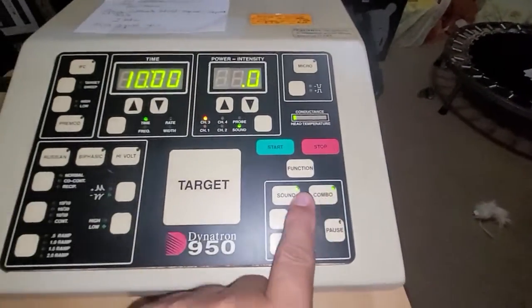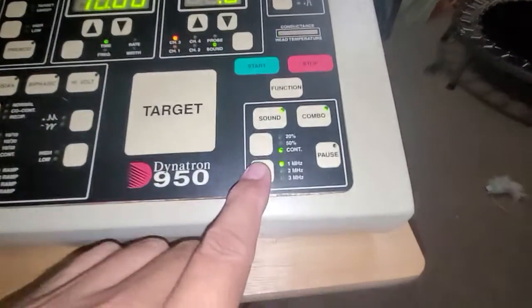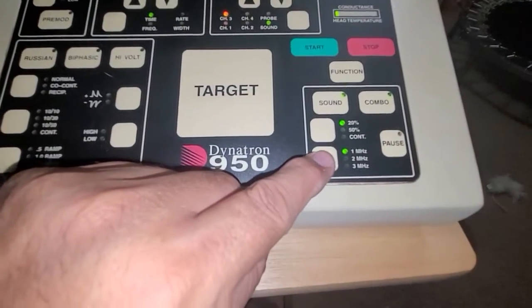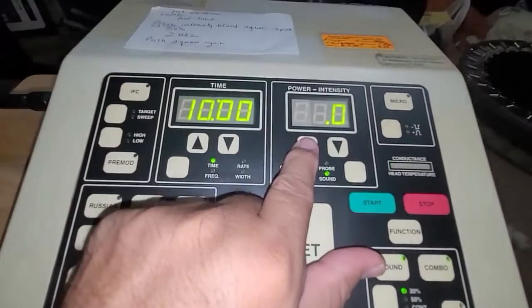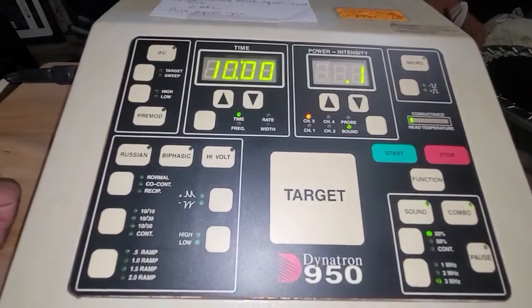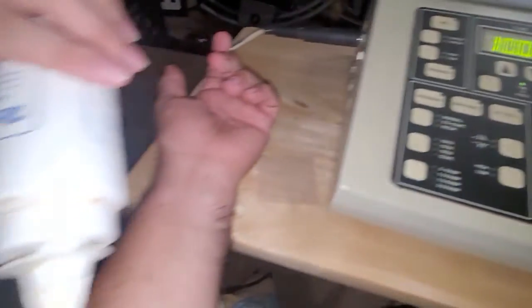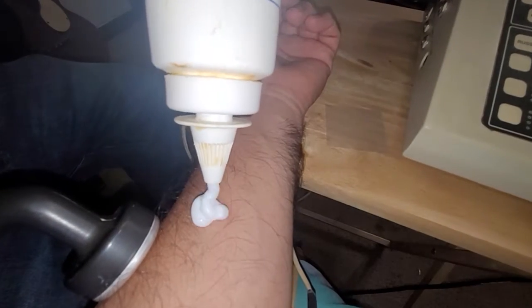It is on channel 3, which is channel 3 here. The combo button, of course, was already touched. This is now in sound mode. So the sound wave will be at 20%. The frequency will be at 3 megahertz. When you push the 1 on there, it's at 0.1%, which is negligible, so you don't have to have the unit on immediately. But the lotion should have already been placed on the patient.